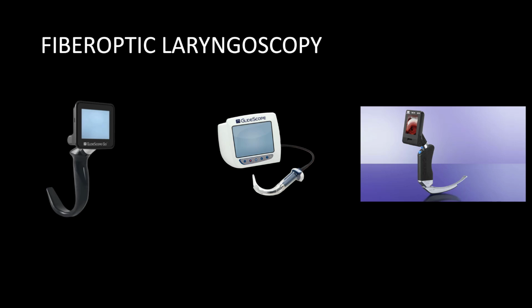There are, in general, two big classifications: the standard geometry video laryngoscope blades that function very similarly to direct laryngoscopy, and the hyperangulated blades that function very differently and allow you to look around the corner, so to speak. At LHSC, we currently stock video versions of both hyperangulated and standard geometry blades, which we'll go into later on.